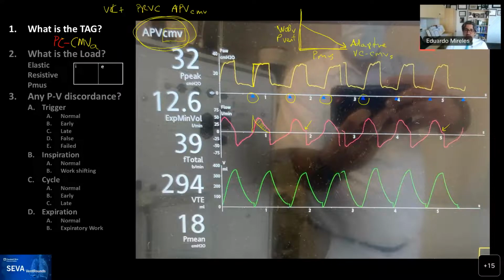So thank you, Ariel. Adaptive pressure ventilation is the name that the company put for this mode, which is probably closer to our tag, and it has several of the items. It would be really useful, I think, if the companies would start putting the actual tag name, even if it's in a parenthesis, so people know what their mode actually does. So great job.